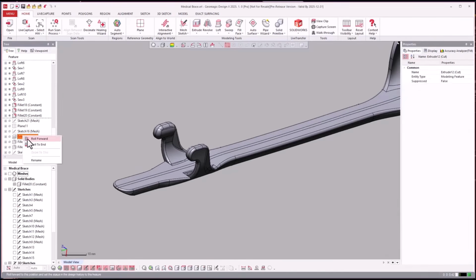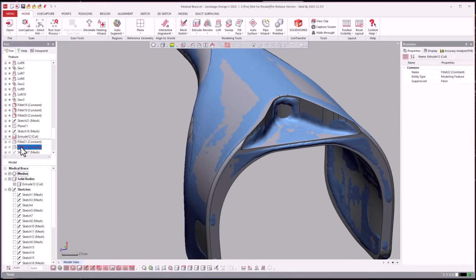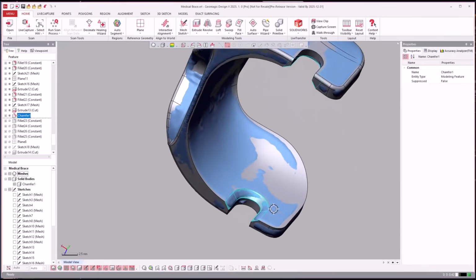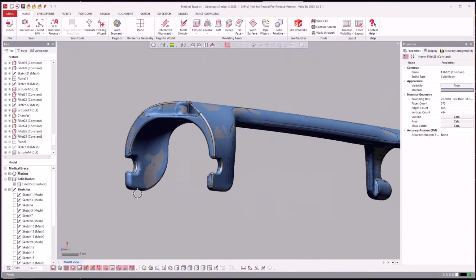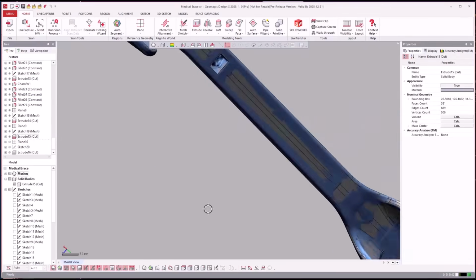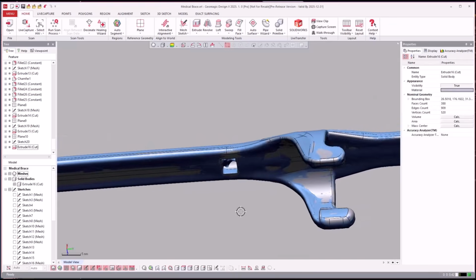I think there's some cleanup work that still needs to be done. On this back side, that's what was going on here, is cutting this piece out, adding the fillets, cutting those pockets away and chamfering those, adding fillets to the chamfers, and then filleting the rest of that. Cutting the hole in the end here. And then you see here there's some connection areas, some pockets that we need to cut out. So there's one of them, and then here's the other one. Cut a pocket out there.